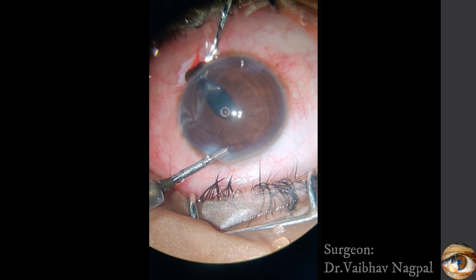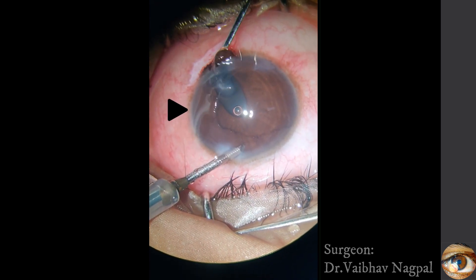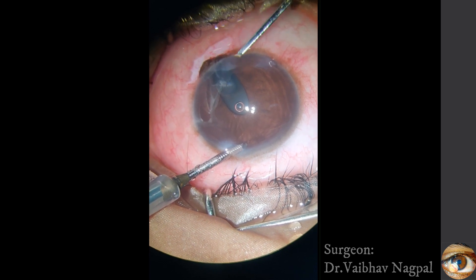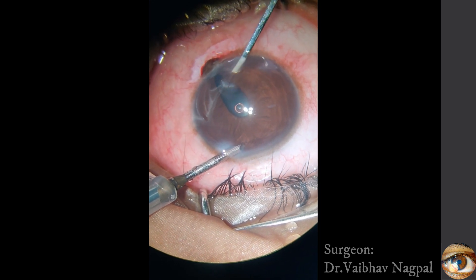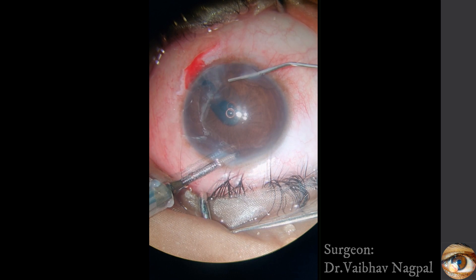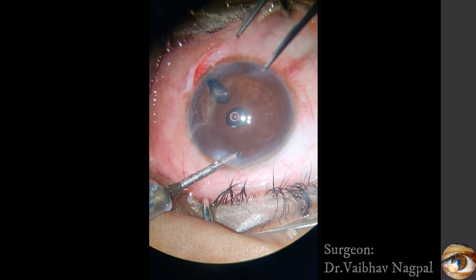Iris tissue reposition is attempted. After realizing that the intraocular pressure is high, flow through the AC maintainer is reduced. As we can appreciate now, the iris can be reposited very effortlessly. The AC maintainer is then removed.